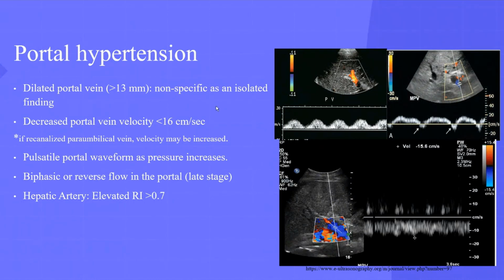This is a portal vein waveform with a biphasic waveform. This is bidirectional. This is a reverse portal vein flow.